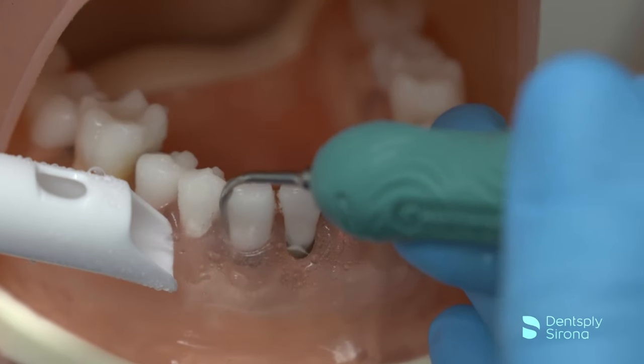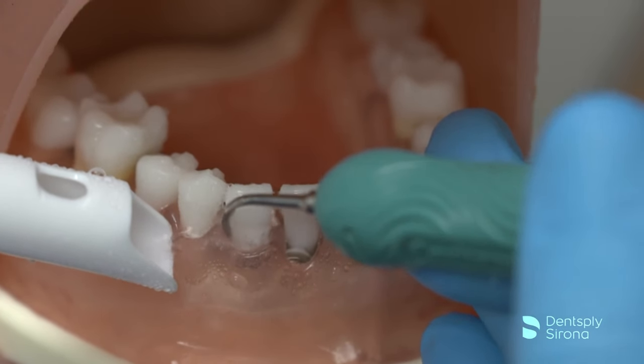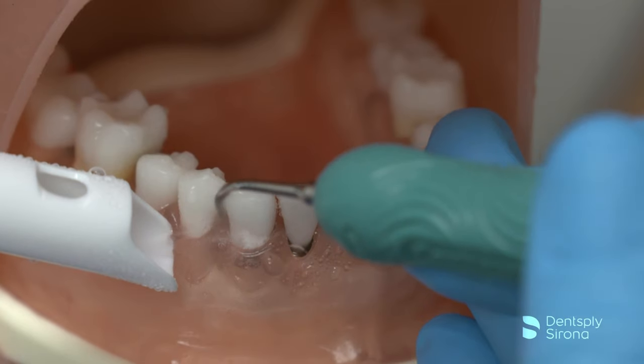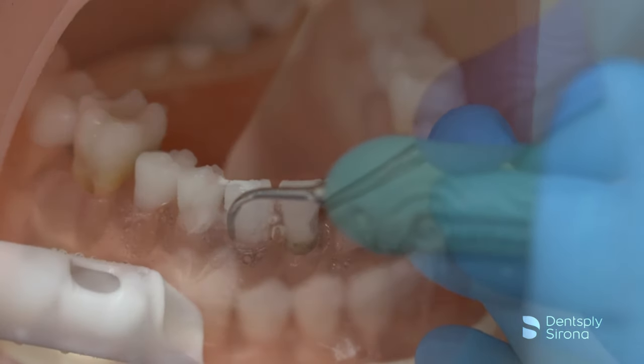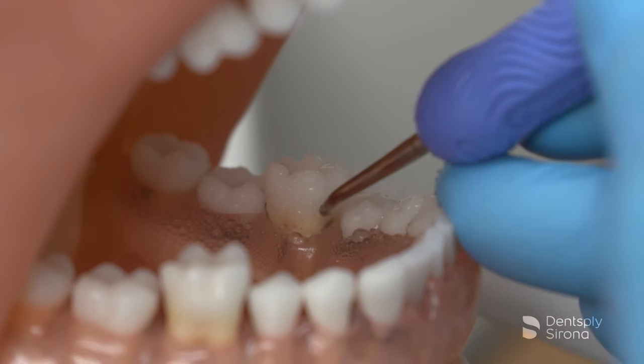Ultrasonic instrumentation plays a key role in today's periodontal debridement procedures. The use of ultrasonics continues to grow amongst clinicians, and proper use and application is essential for optimal clinical outcomes.